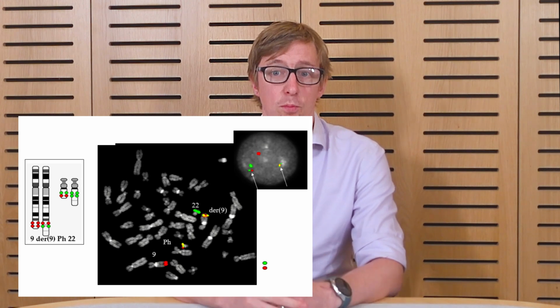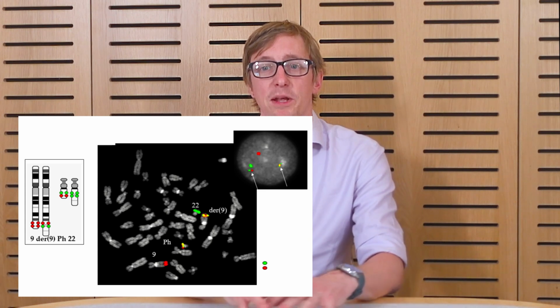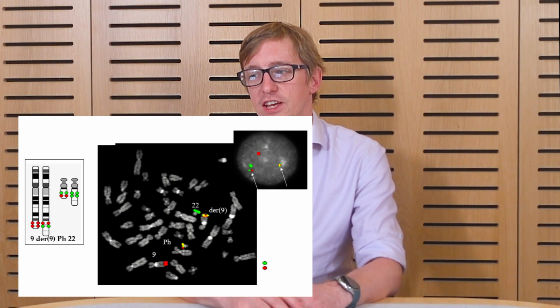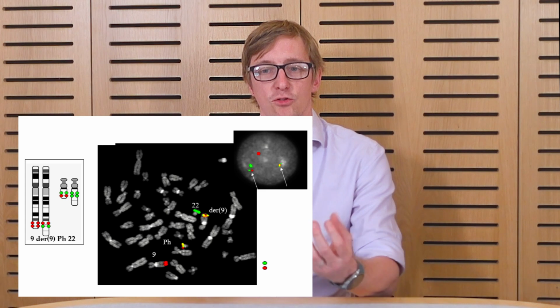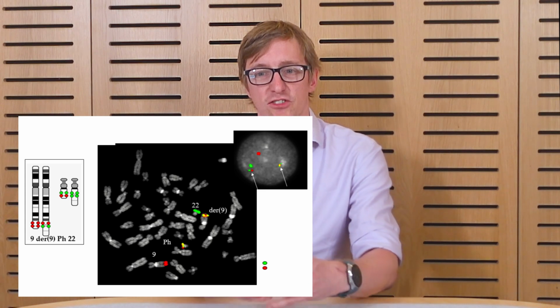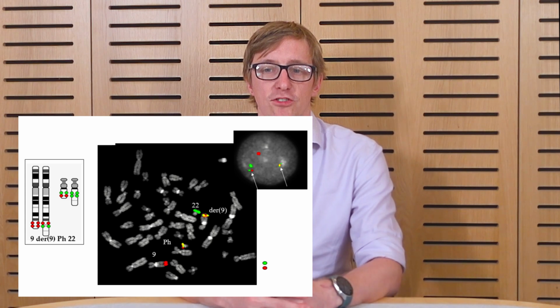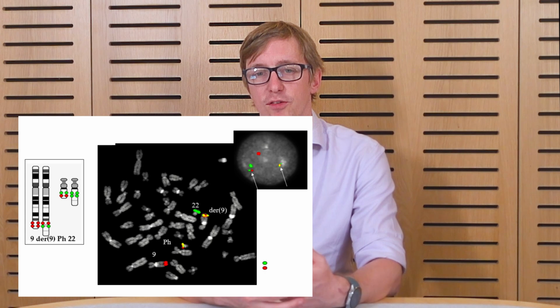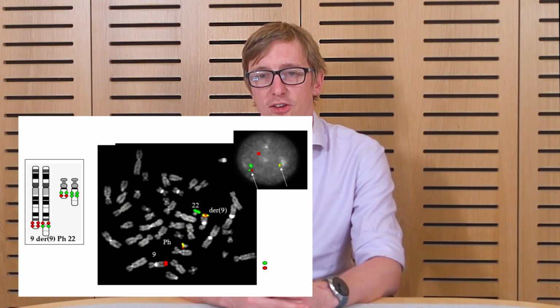And in a normal, healthy individual, these two probes, when you look at these cells on the microscope, will be nicely separated. But as you can see in this picture here, if the green and the red light gets put together, that means the two genes for which these probes have stuck to have become stuck together. And this is an example of a positive, what we call FISH test, to demonstrate this patient has a BCR-ABL fusion. So that's really important. There are different ways to do it, as I said, but we have to demonstrate there's a BCR-ABL fusion.